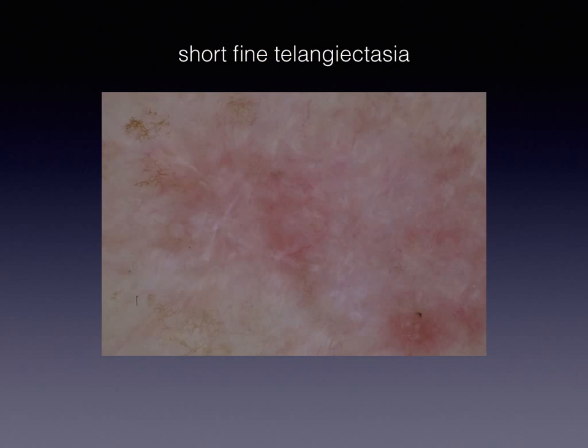The second type of vessels that can be seen in basal cell carcinoma are the so-called short fine telangiectasias, which typically characterize superficial basal cell carcinoma. These vessels are not prominent, not in focus, and might be seen either in the center or at the periphery of the tumor. However, they are still always linear.